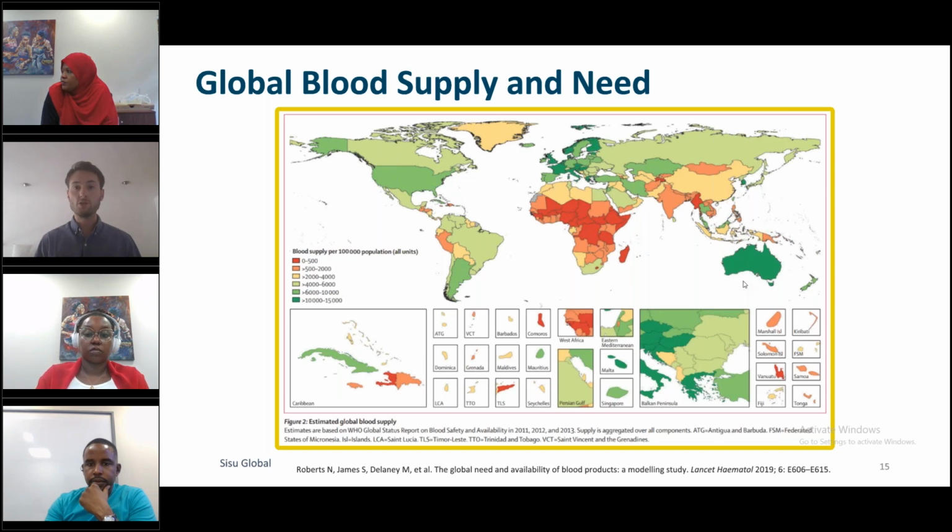They were able to salvage 2 units of that patient's fresh whole blood, start transfusing that blood, and start finishing their surgical operation before the donor blood had even arrived from the lab. As a result, they were able to tell the lab, thanks, but no thanks. Our patient's been stabilized. We don't need this donor blood. And that donor blood was sent back to the lab to be made available for another patient.